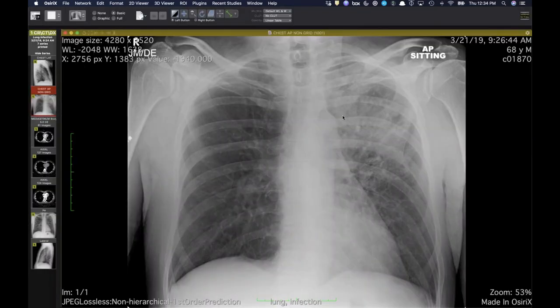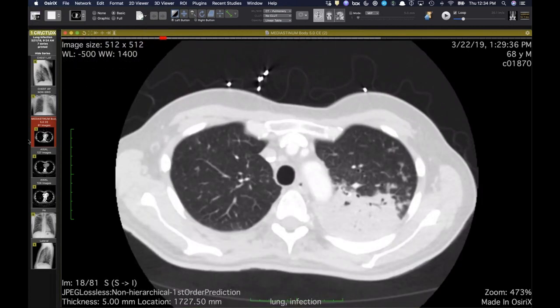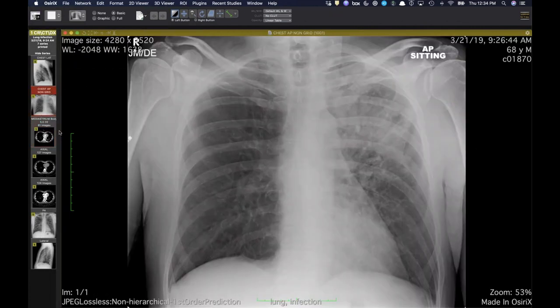And then there's this patient who came in. This is to an outside hospital last year. And you can see there's what looks like a lobar pneumonia. He has cough and fever and maybe some other nodular foci of airway spread of infection in other lobes. Now he ended up getting a CT, and this was the next day.